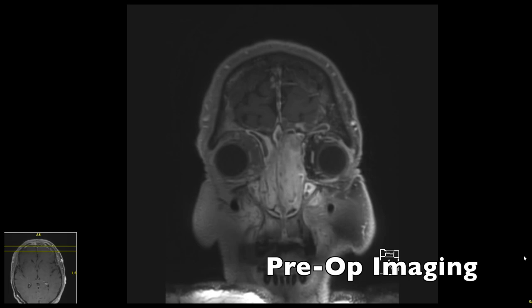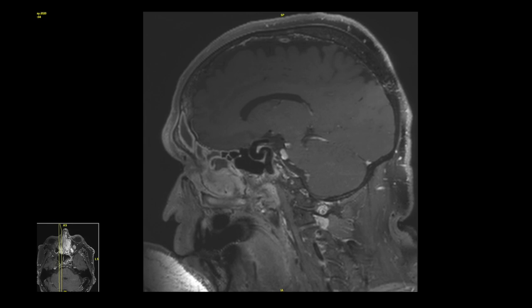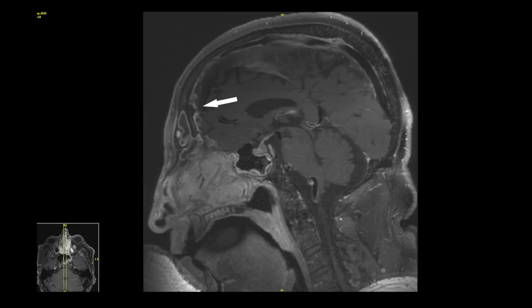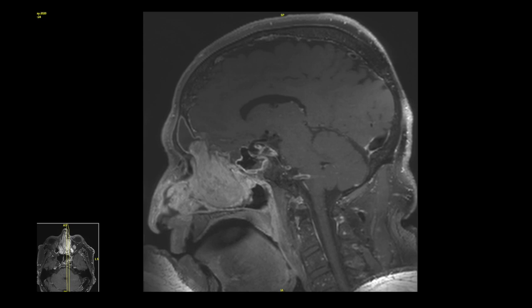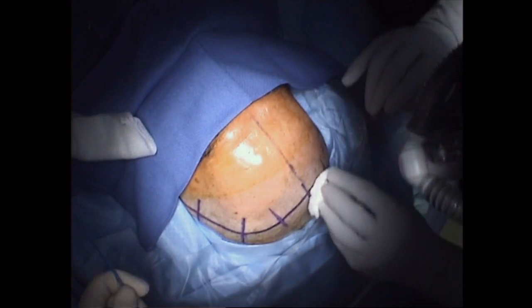Here is the patient's imaging studies. You can see he has a fairly extensive esthesioneuroblastoma primarily involving the left side of his nose but also crossing midline. On this sagittal MRI scan, there is quite a bit of dural nodular enhancement that crawls up the posterior table of the frontal sinus nearly to its apex. We elected for a combined open and endoscopic approach to maximize our exposure to the posterior table of the frontal sinus where this involved dura was.